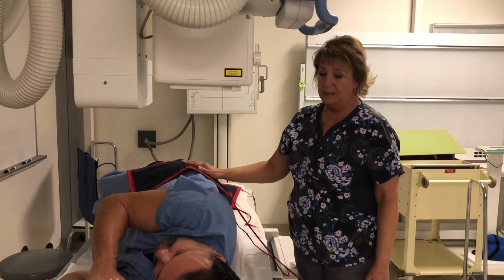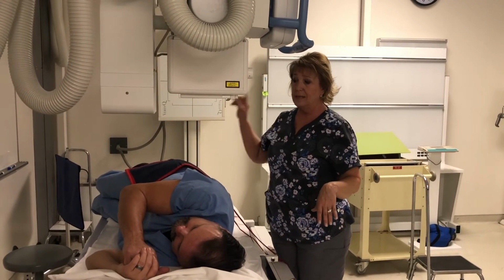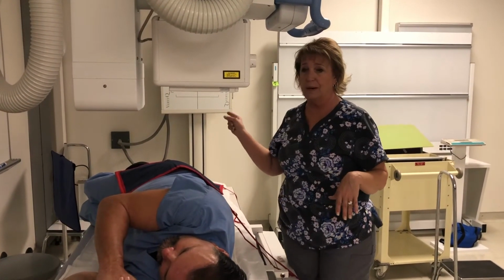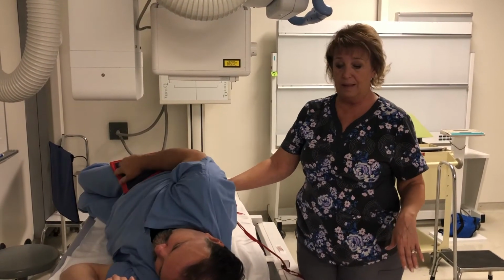Okay, one more position is the lateral recumbent version of the swimmer's view. I demonstrated the upright swimmers, which is called a twinning method, and the lateral recumbent version of the swimmers is called the Pawlow method.